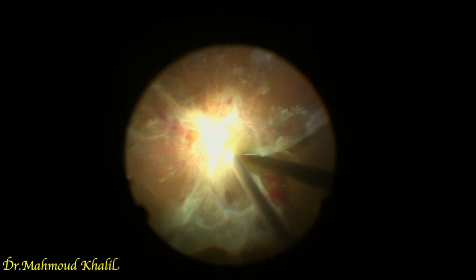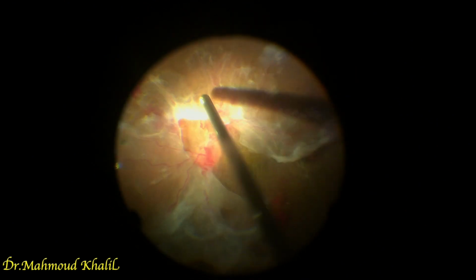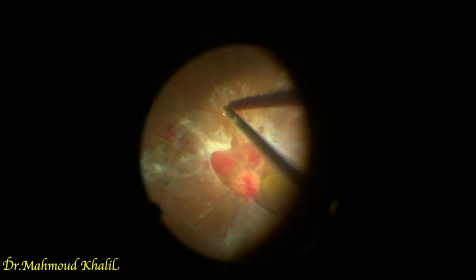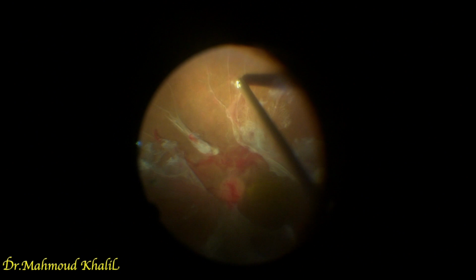The third case is an example of advanced PDR. The patient didn't do any laser before, so there are aggressive proliferations extending from the optic disc to the extreme periphery. Using the cutter can help to eliminate all of these proliferations. The cutter can act as a forceps, catching the membrane with mechanical force or even with vacuum, and can act as a scissor, cutting the bridges and cutting the epicenters.